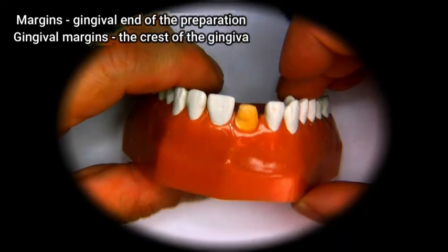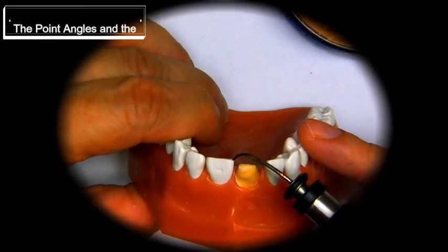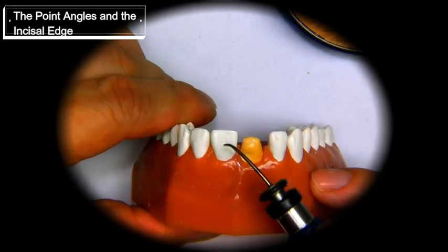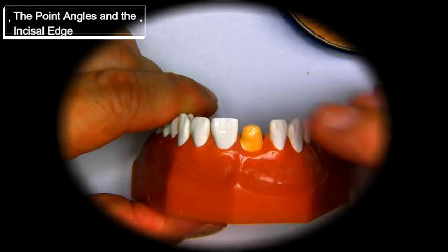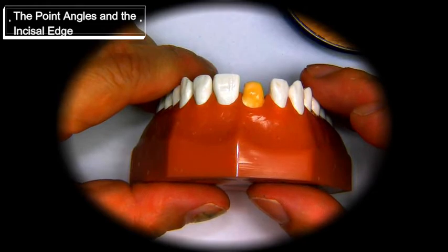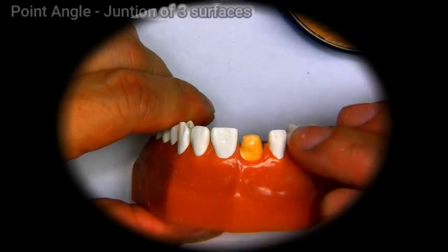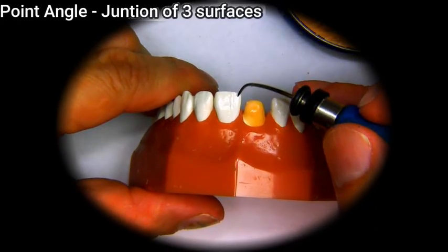Now the next step is to try to replicate the areas of the point angles. So if we look at it, the central incisors are slightly longer than the lateral incisors, although not for everyone in this model is true. But in an ideal case, centrals are a little bit longer than the laterals. So the point angles should match up to this central incisor.